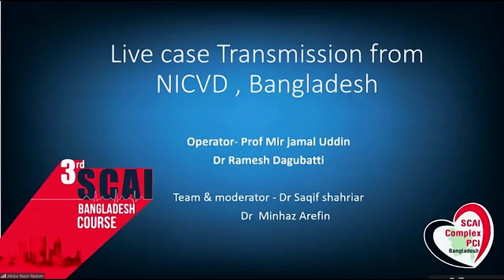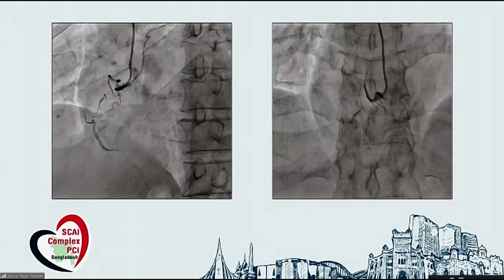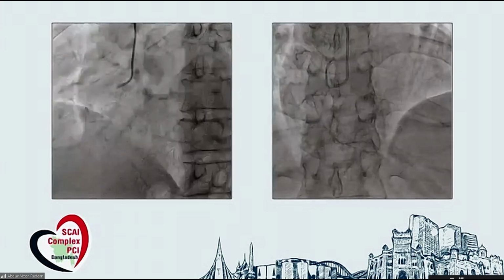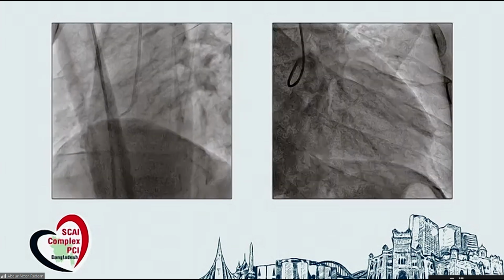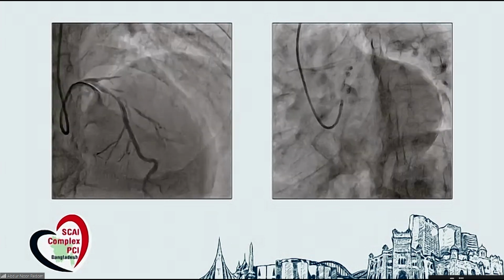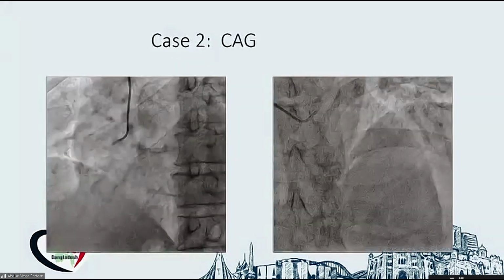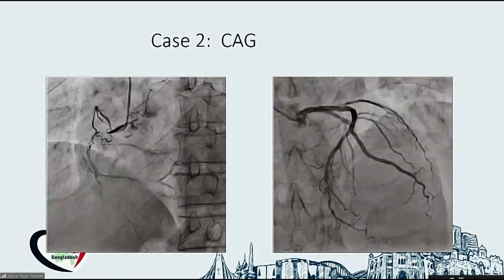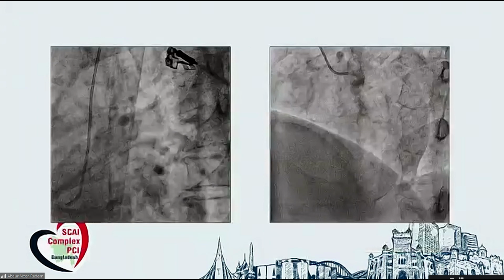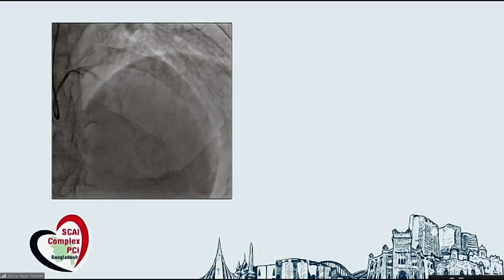A 47-year-old man, a young man, having old anterior MI and left ventricular ejection fraction 45% with viable myocardium in the LAD territory. It was found that it is a left dominant system, and out of that the LAD was totally occluded, and the distal left circumflex, that is LPDA, also has a significant lesion, and RCA is a non-critical lesion. RCA is a non-dominant vessel. It was tried in another center with the wire crossed, but they were not able to cross the balloon, and that is why we kept this for the conference.